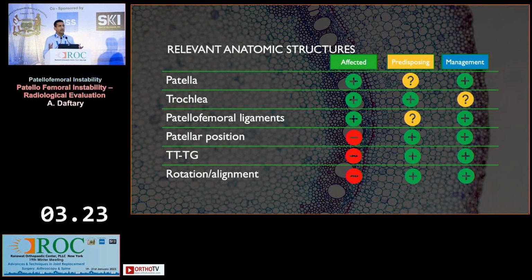And on radiology, we can give you information about all of these structures that can help you in that decision-making process. But I would warn against purely using imaging to make your decisions.